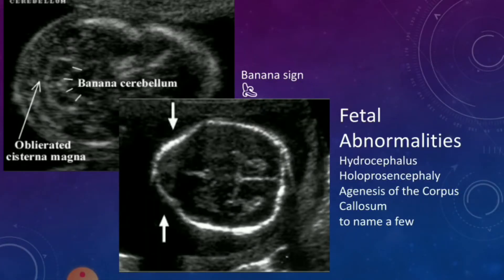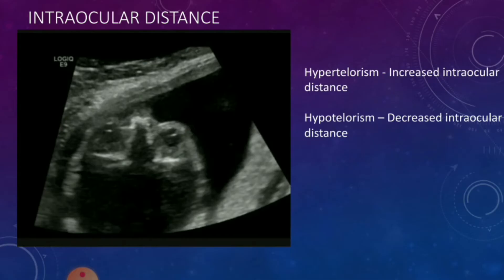A transverse view of the eye can give you the intraocular distance and give you hints as to whether they have hypo- or hypertelorism. Focusing on the eyes, you can see fetal movements like the lens moving side to side or around. You can also see blinking if you're in a coronal view.